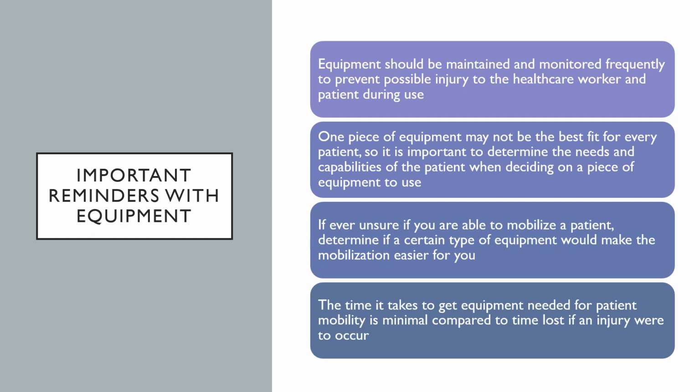If ever unsure if you are able to mobilize a patient, determine if a certain type of equipment would make the mobilization easier for you. The time it takes to get equipment needed for patient mobility is minimal compared to the time lost if an injury were to occur.